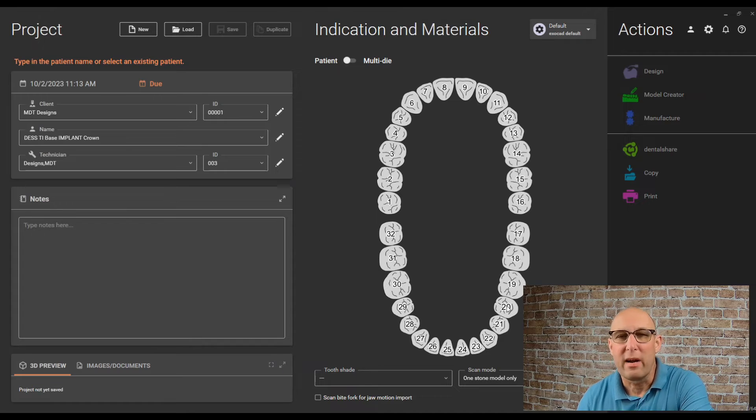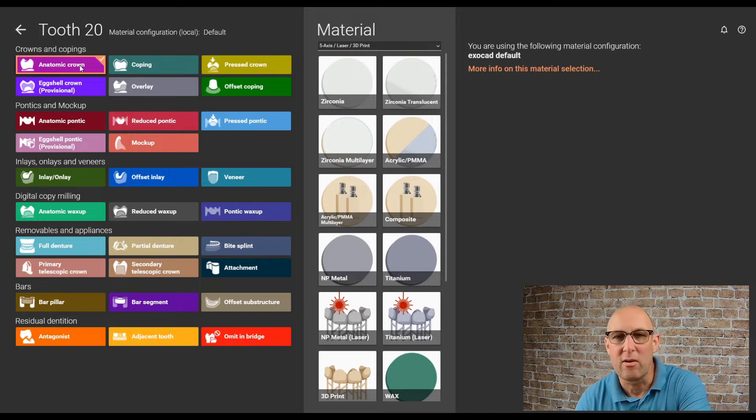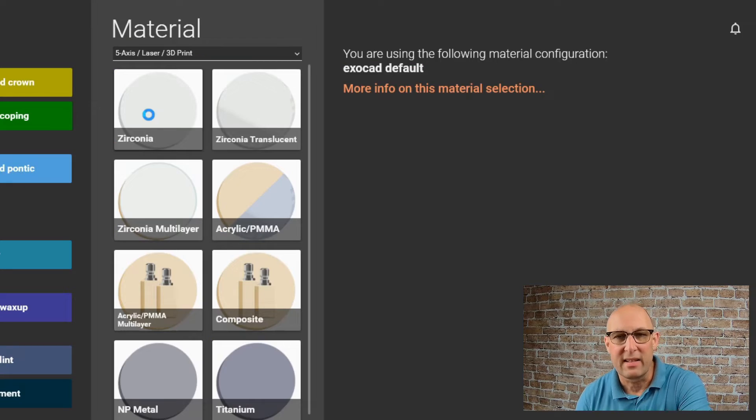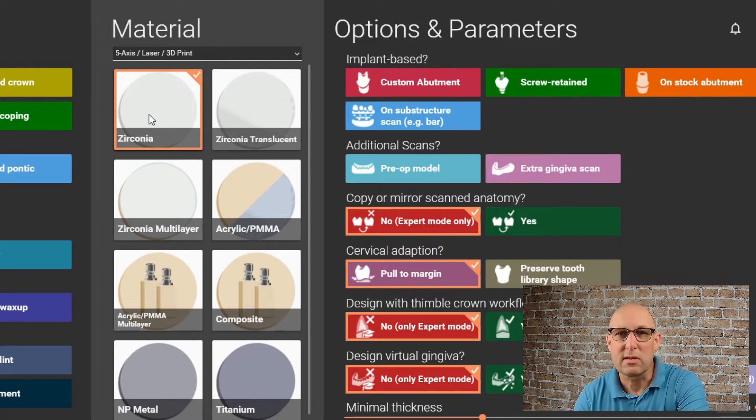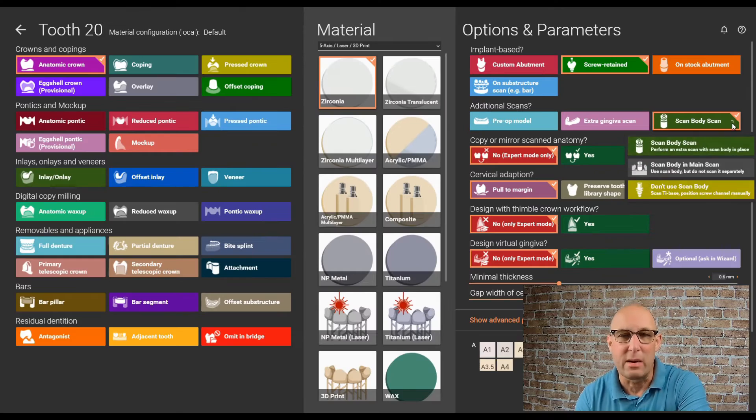Welcome back to the video. The order form is nothing special. Click number 20 — in this case it's my restoration site. Atomic crown, I'm going to use Zirconia in this restoration. It's of course screw-retained. If you have a separate scan body scan, like in this case, hit the green button — that's extra scan body.